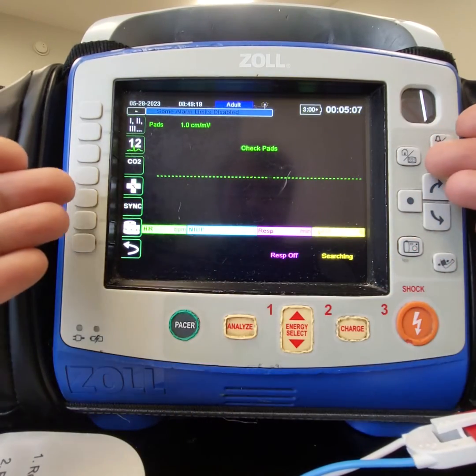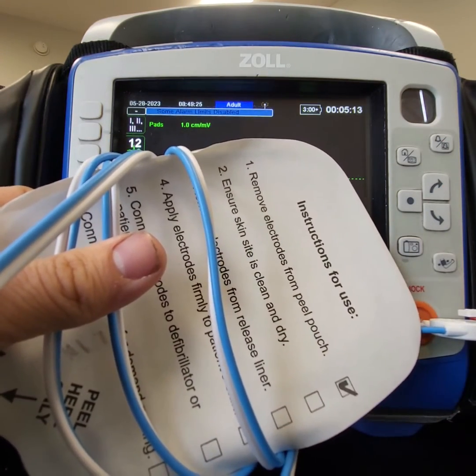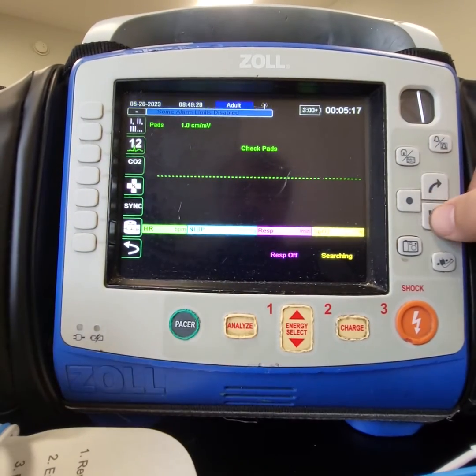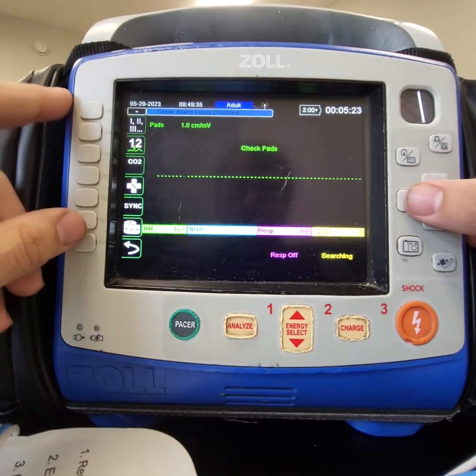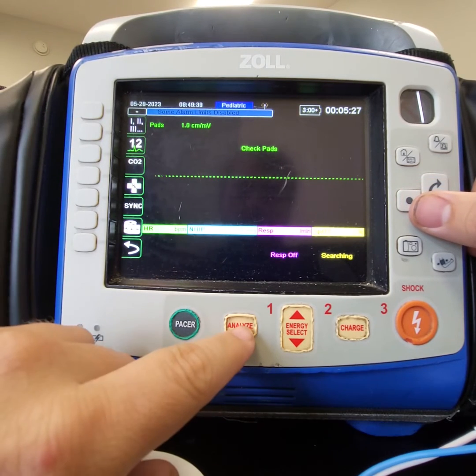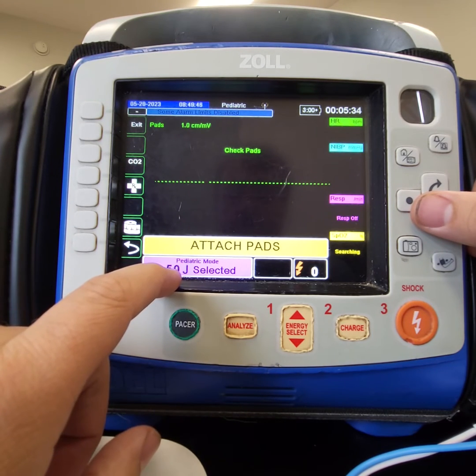You'll notice on the monitor nothing changed. The monitor has no idea whether or not you want to do adult or pediatric, so we need to be able to change that. Up here where you can see the little highlight, we're going to go to adult and change it to pediatric. Now whenever we switch to AED mode — attach pads — you'll see that 50 joules is selected.